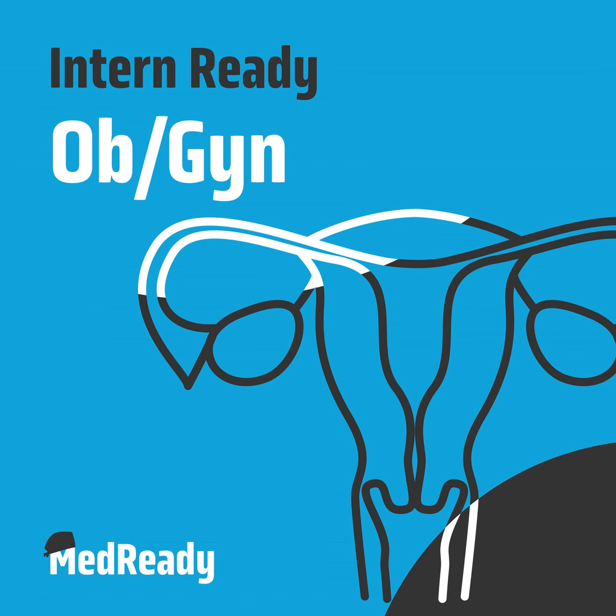The reason why it's important is because anyone who's seen a cervical lac knows just how much they can bleed. Of course, you want to control the bleeding, but also it's going to be impossible to see anything with your hysteroscope. And so you might need to repair with sutures if that is fairly significant. Yeah. And one trick that I was told as an intern was, don't take a baby bite with the tenaculum because that's going to be more likely to tear. I was always so nervous to take a big bite of the anterior lip of the cervix. But if you have a good visualization, get a decent bite so that it does not tear.